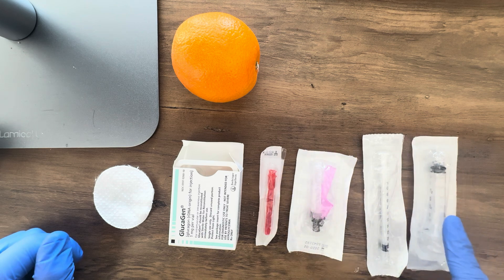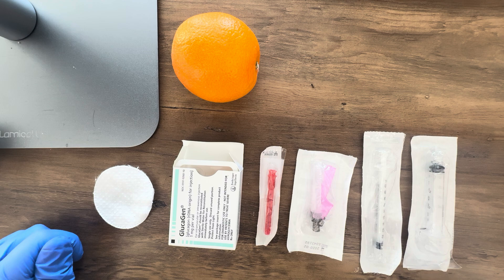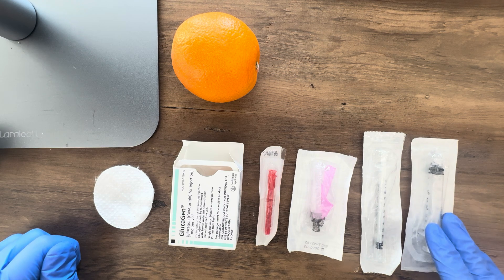You'll also need to choose a syringe. Glucagon is going to reconstitute to one ml, so we need anywhere between a one ml syringe to a three ml syringe. For demonstration I'm going to be using the three ml syringe.